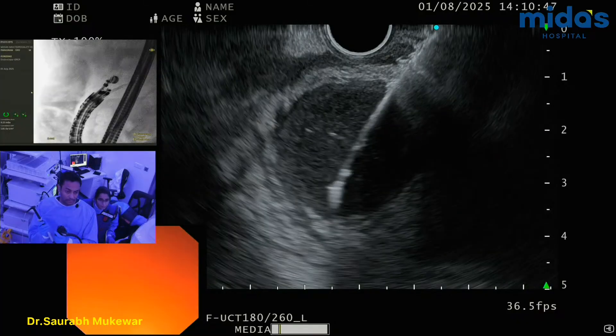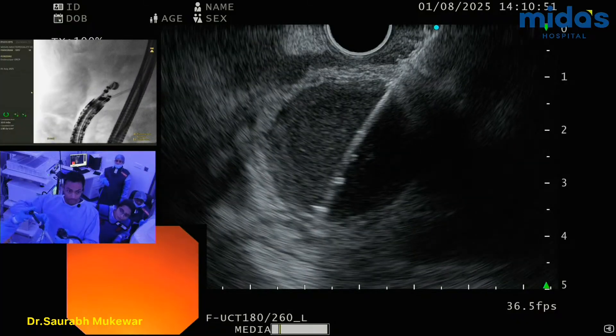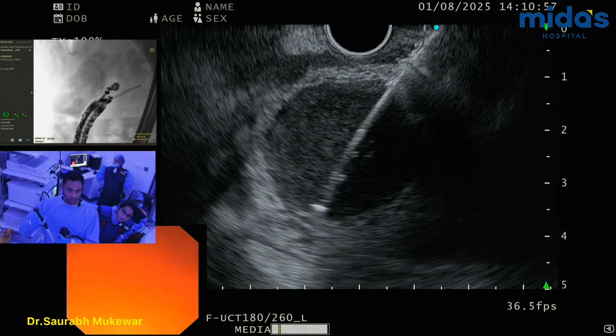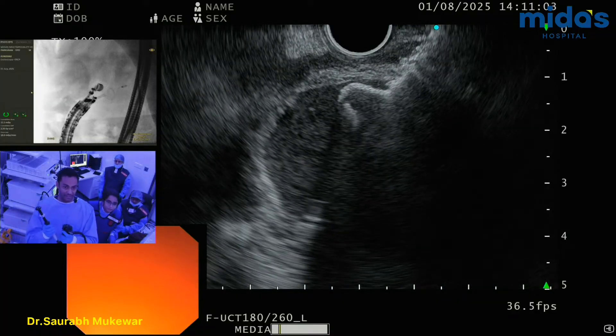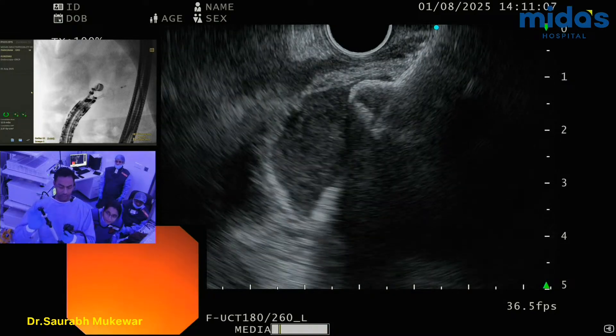So, we're in. Across to the opposite wall. Done. Okay, remove that. So I've done the first one, locked. Step two is perfect, right? Yes. And now I've done two.